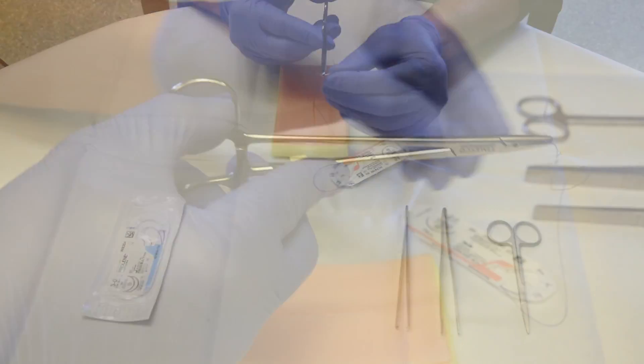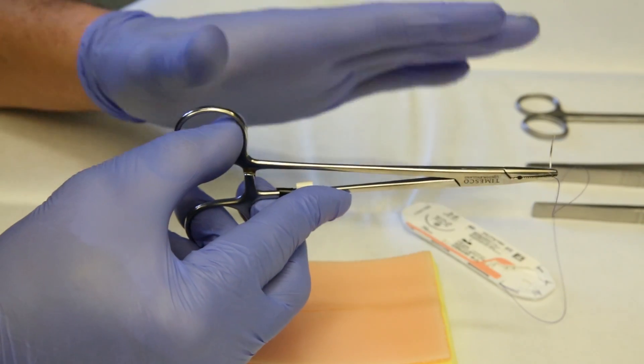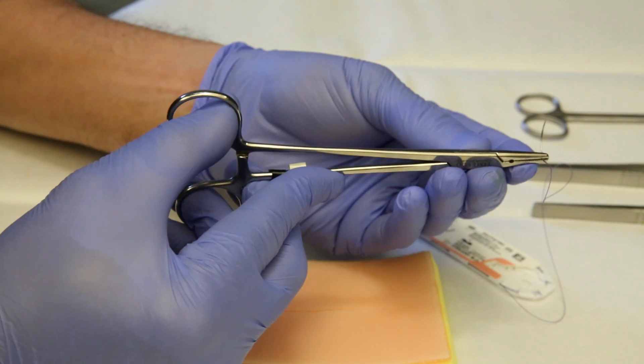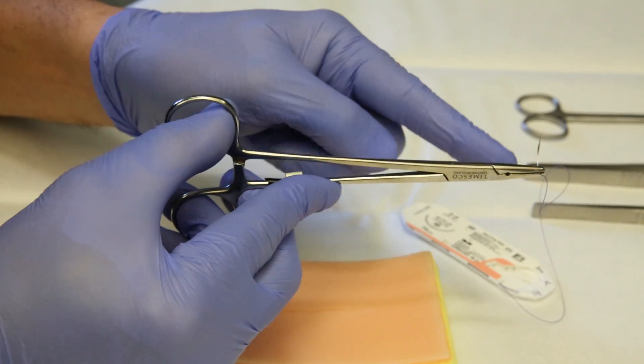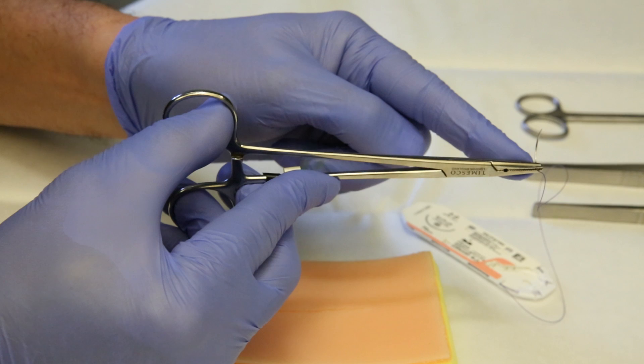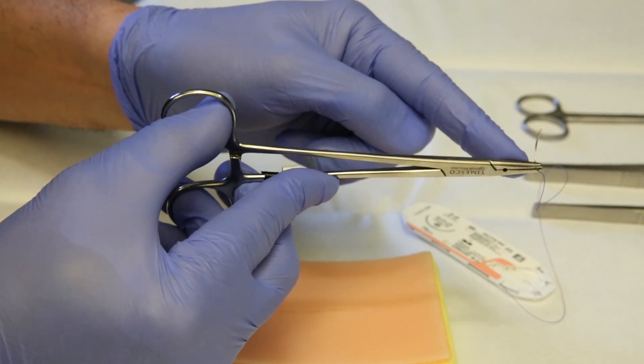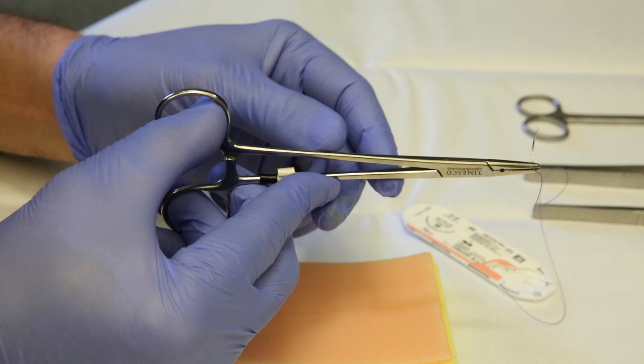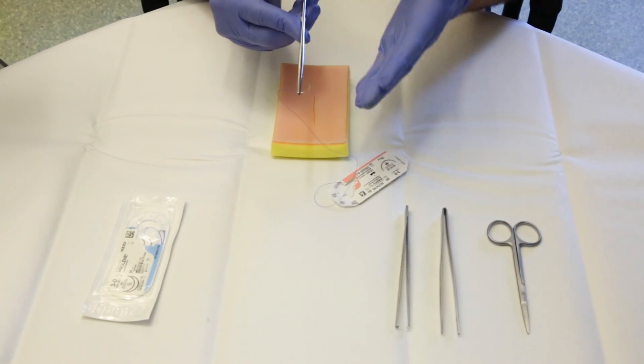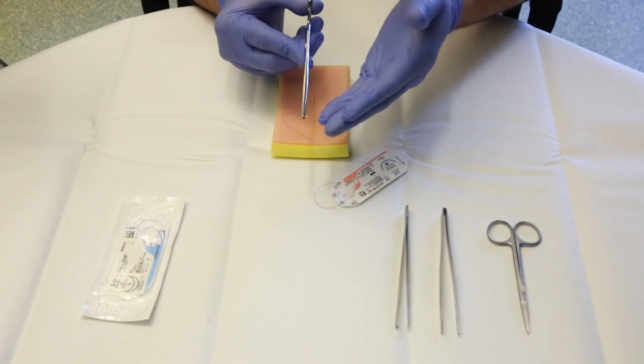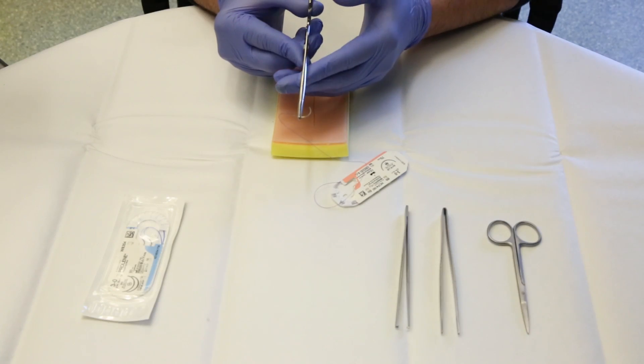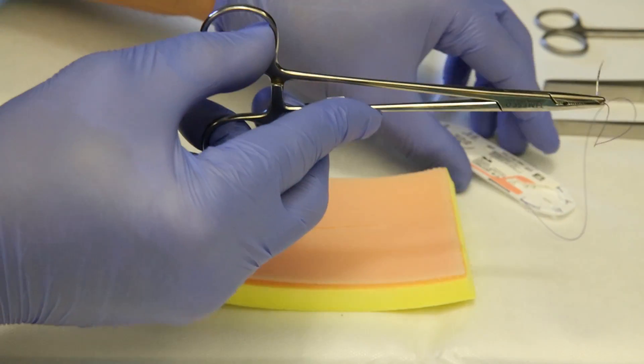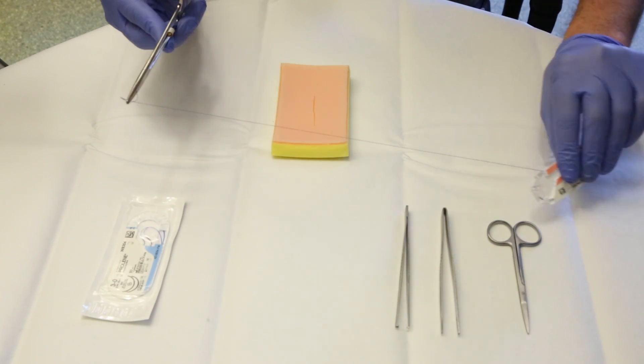As you see here, the needle has to be on the tip of the needle holder and about a third or quarter from the end of the needle. And it has to be facing you, smiling in front of you. This is the right way to hold the needle holder. Not this way, not this way. So this is the right way. Now we take all the thread out.